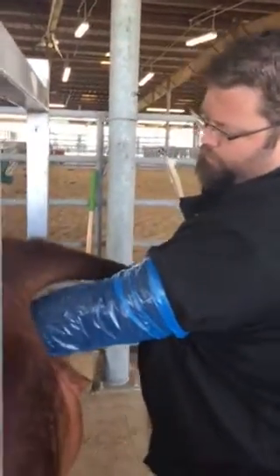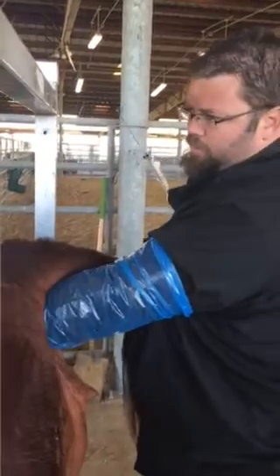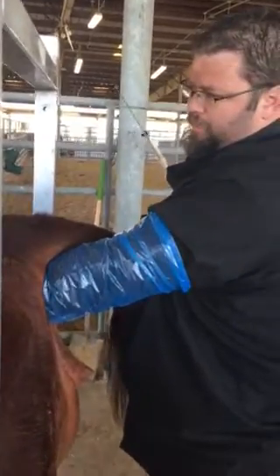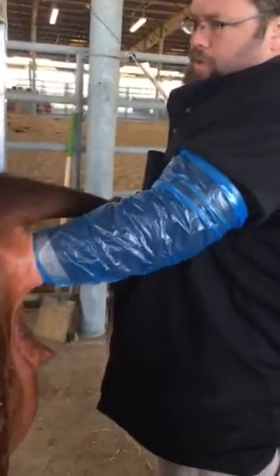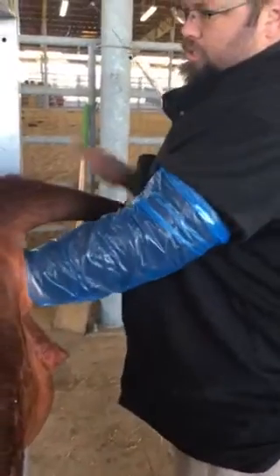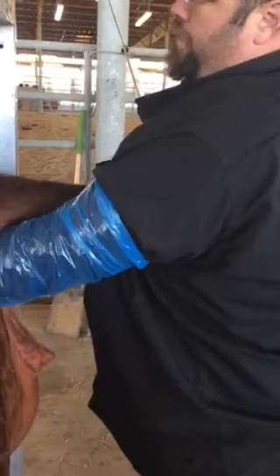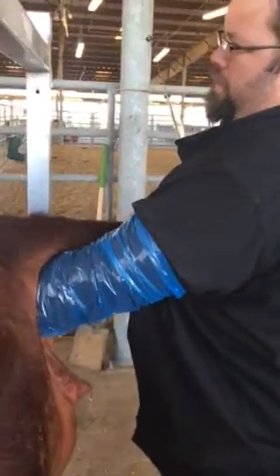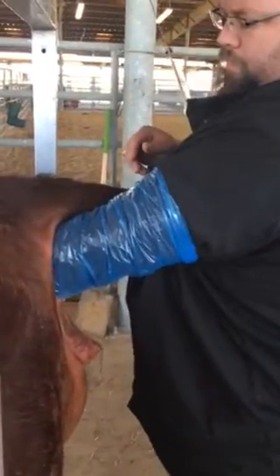What you're looking for through the rectal wall — she's going to push against you and that's okay — is I'm feeling for her cervix. Start immediately when you go in and just make a sweeping motion until you feel, and I feel it right there. Her cervix is not very far down.